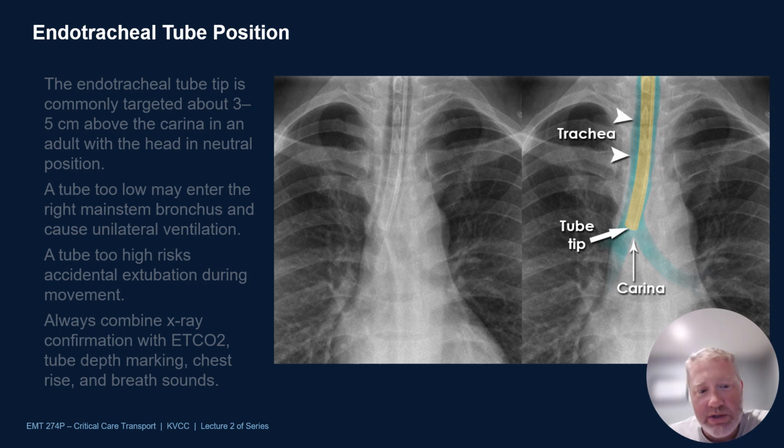Chest X-rays are good for confirming placement when you already know that you're in the right spot, based on your end tidal reading and the measurements on the ventilator and confirming chest rise and making sure that the breath sounds are equal and bilateral. But still, always a good double check.